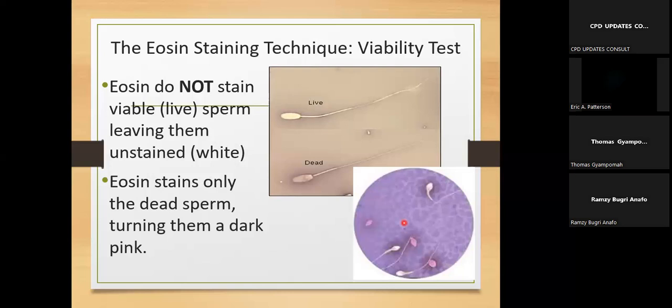Okay, so you strike out the percentage. So, for example, you are getting a total of 6 sperms. Out of the total, 3 of them are dead. So it becomes 50%. As simple as that. Okay, very, very simple. All right, but like I've said, you don't do it for every test, especially if the motility is already high. You don't need to do it.